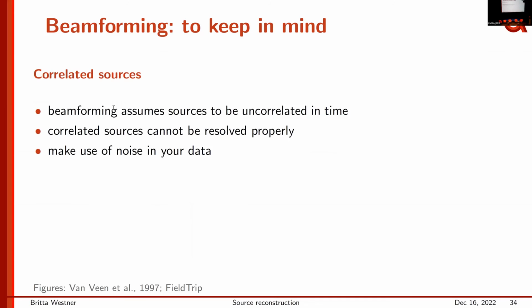That, of course, means that you average out a lot of noise that might be uncorrelated, and you only keep the auditory potentials that are arguably quite correlated between left and right auditory cortex. Nowadays, and this is something also for you to keep in mind, most toolboxes do that automatically without you having to tell them.